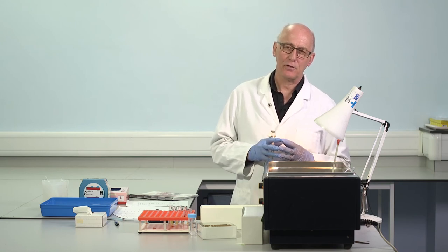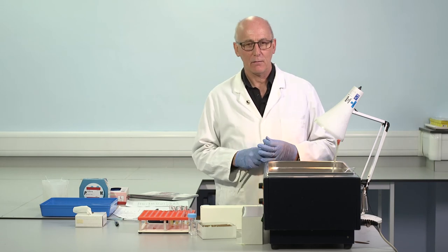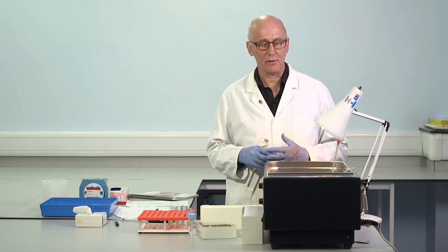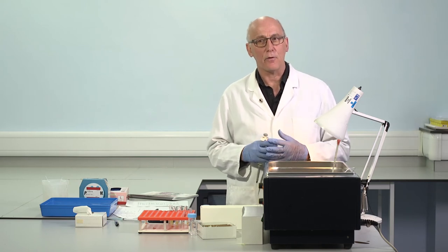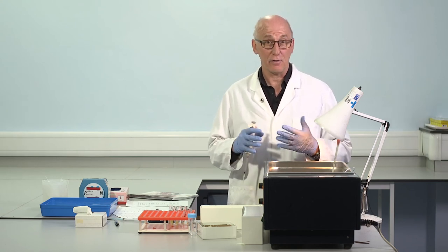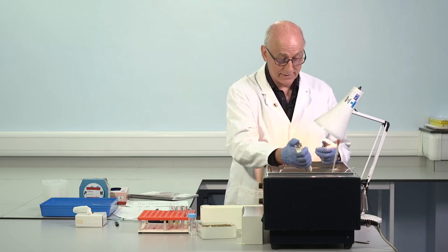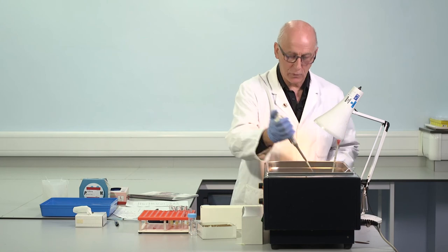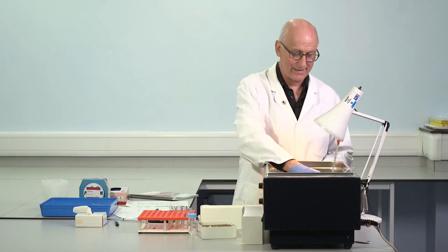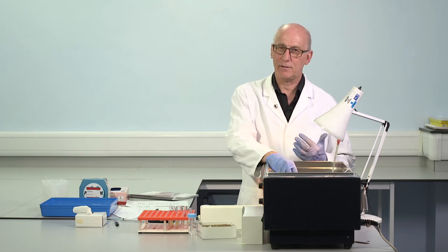But I think another reason is because very frequently laboratories are using APTT in several very different settings. Even those of us particularly focused on bleeding disorders and wanting to detect mild hemophilia A, mild hemophilia B and so on, even those laboratories are usually also doing tests in patients with other problems and are very frequently also monitoring unfractionated heparin therapy. And I may also very often be looking for the presence of lupus anticoagulant. And so we're really asking several different questions of the reagent. And in many centres, and there are practical advantages, a single APTT reagent is used for these very different functions.